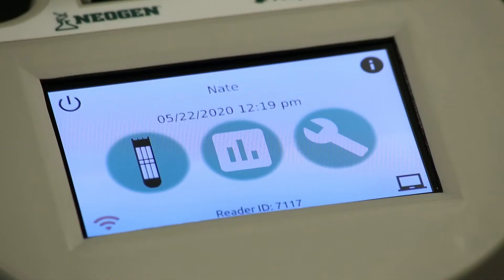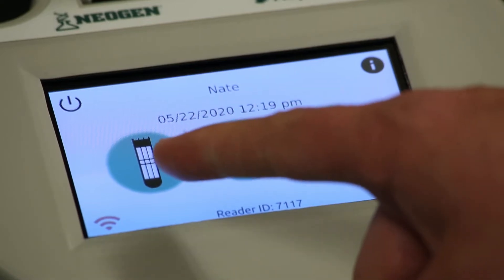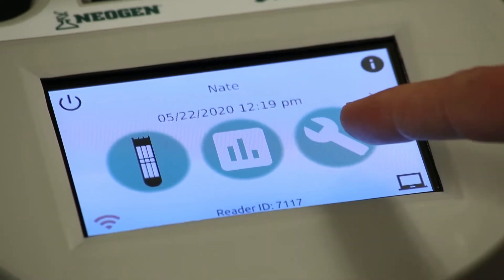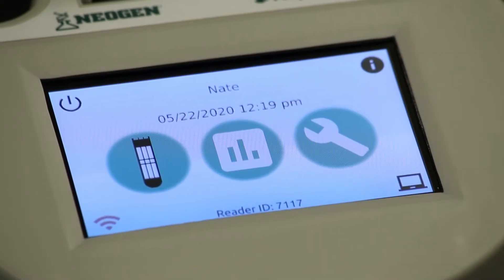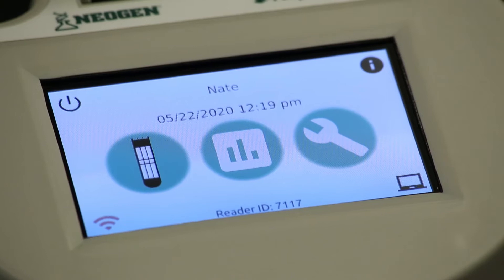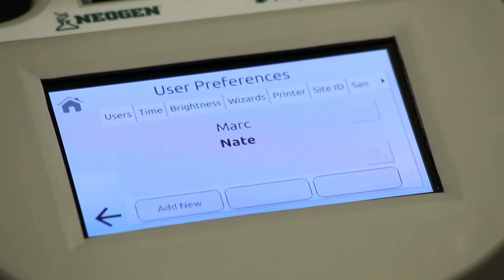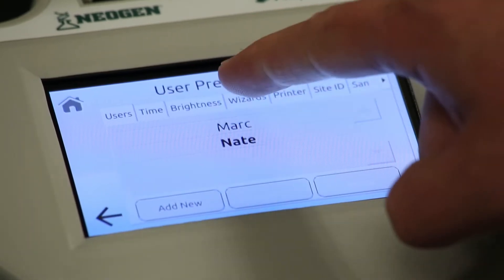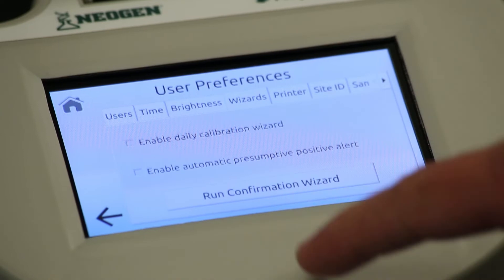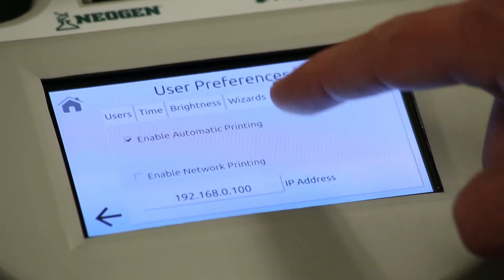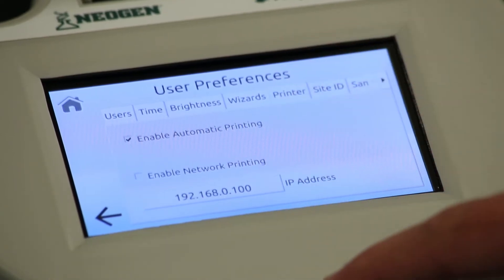The home screen has three main icons: run test, test results, and settings. Touching the username takes you to a user preference screen where you can adjust a number of options, including time and date, enable automatic printing, wizards, etc.